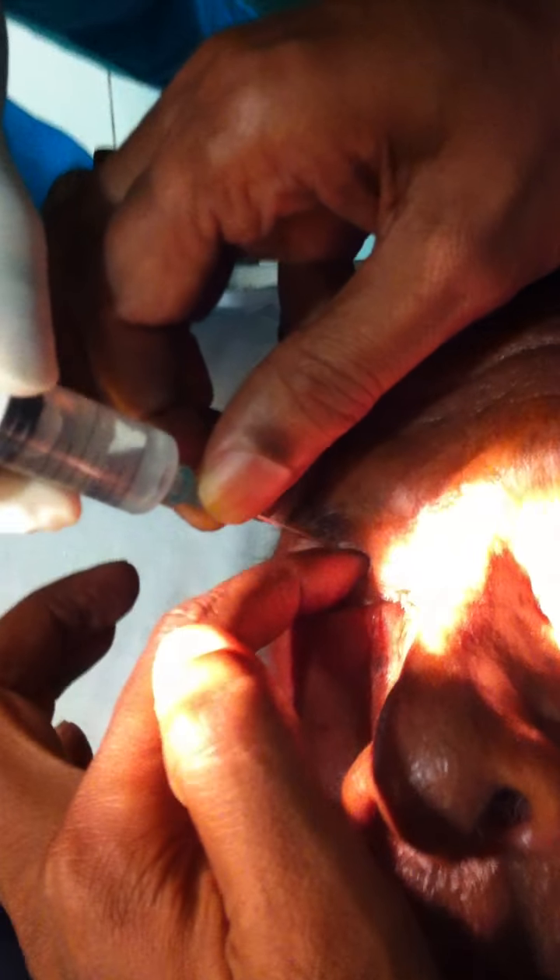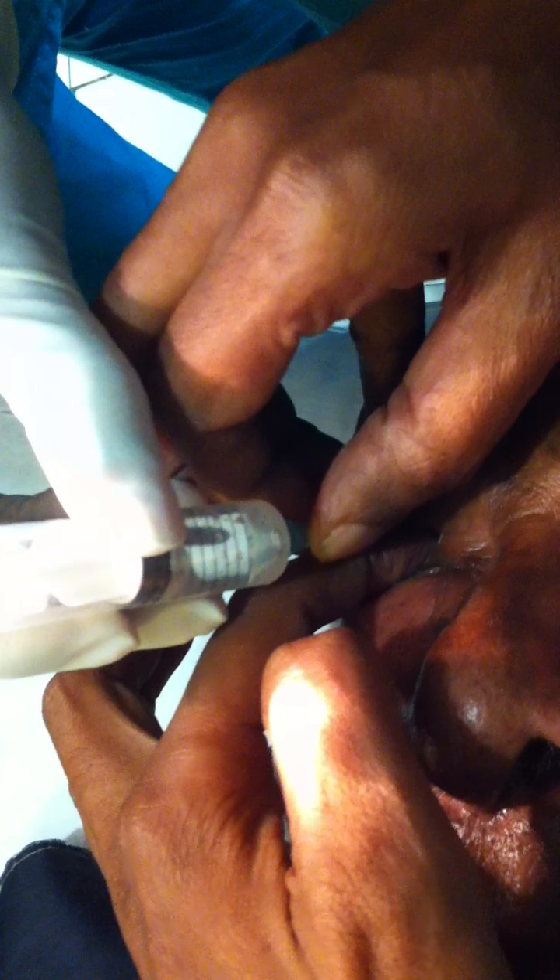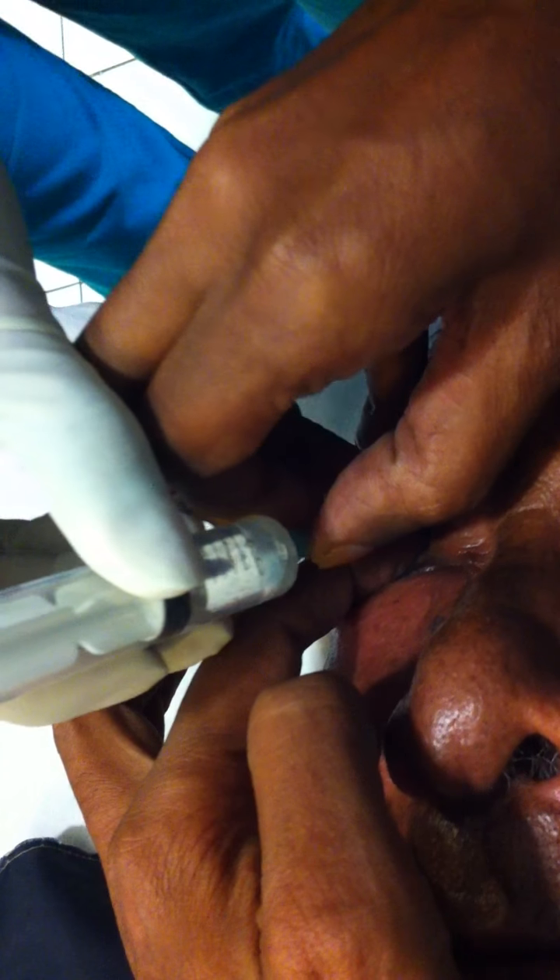Remove your nail. I'm placing mine because I want to be sure of what you should do. Okay, this side — touch the bone there. Touch the bone — the bone will let me feel.